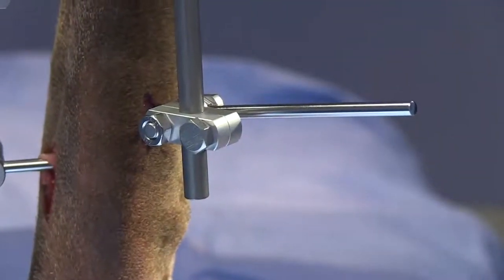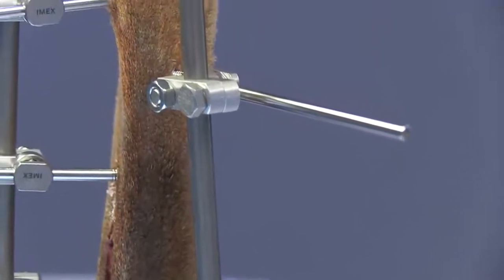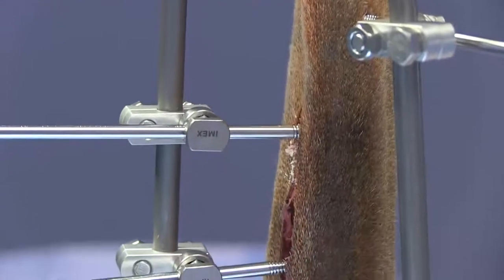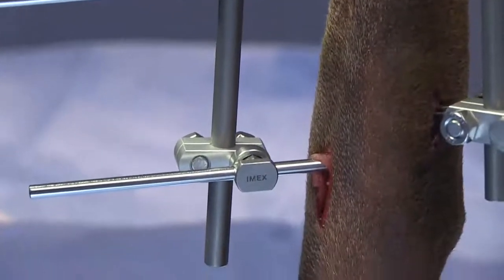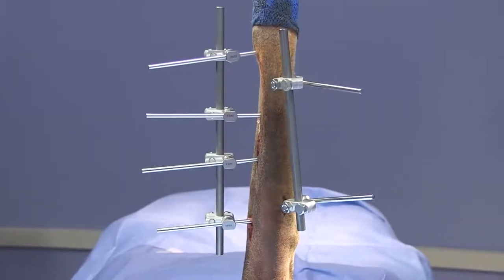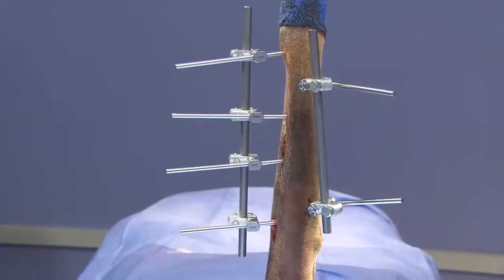One thing to keep in mind is whether we need to be adding additional fixation. Optimally, we try to have three pins engaging the distal and proximal fragments when applying these fixators — and you can see we have that with these two planes. If this were a longer leg, a bigger dog, or a situation where the animal's fracture score put him in a position needing a more rigid construct, it would be fine to place additional pins in these locations or potentially off the ends of this rod. For this animal and the fracture we're currently dealing with, this construct should be plenty sturdy and rigid to get this animal through to healing.